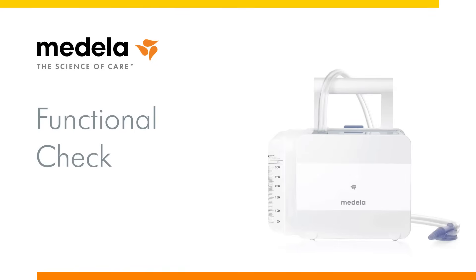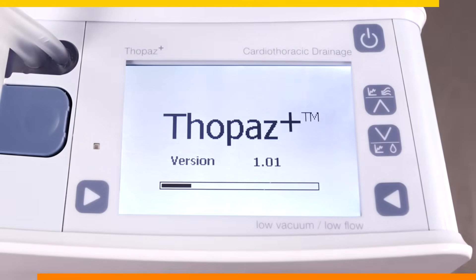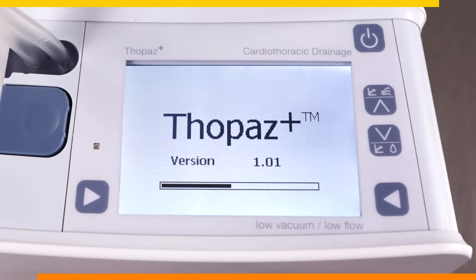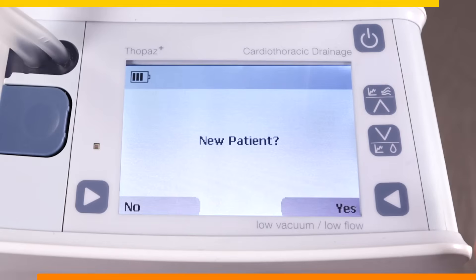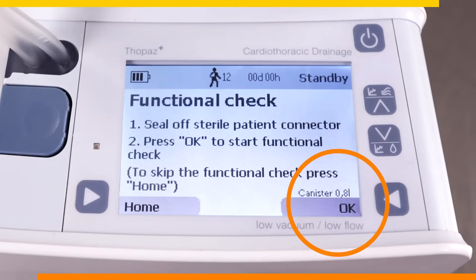A functional check needs to be completed every time therapy is initiated with a new patient. Turn the pump on by pressing the power button on the top right corner of the device. You will notice that the device begins to carry out an internal diagnostic check prior to prompting whether there is a new patient. Once the new patient is confirmed, we are ready to conduct the functional check. On the bottom right of the screen, double check that the canister size matches the size of the canister that is attached.